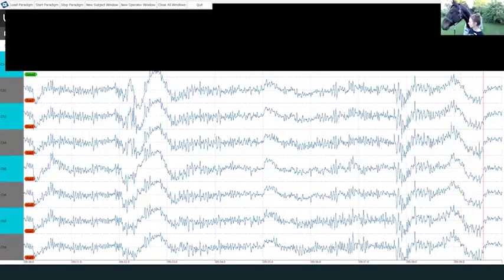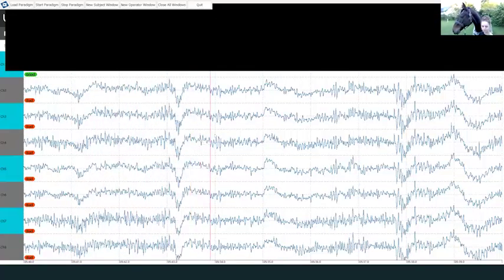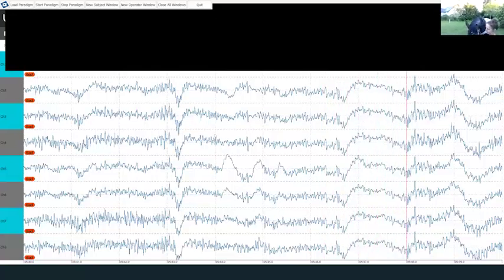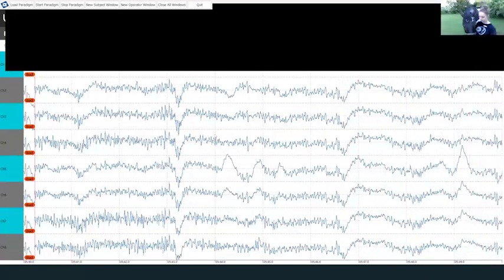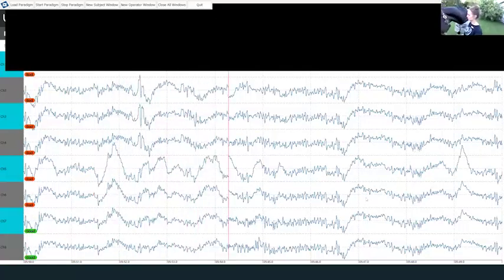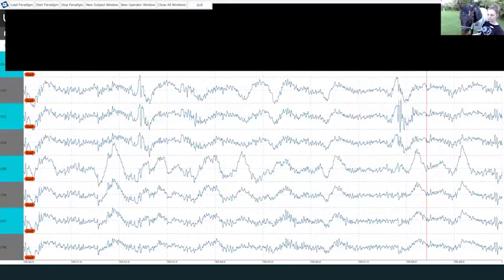Yeah, so I think we showed most of the setup and how we would handle it, and it's actually quite fast. We can already start answering questions, Christopher. We can also do some more movement experiments.